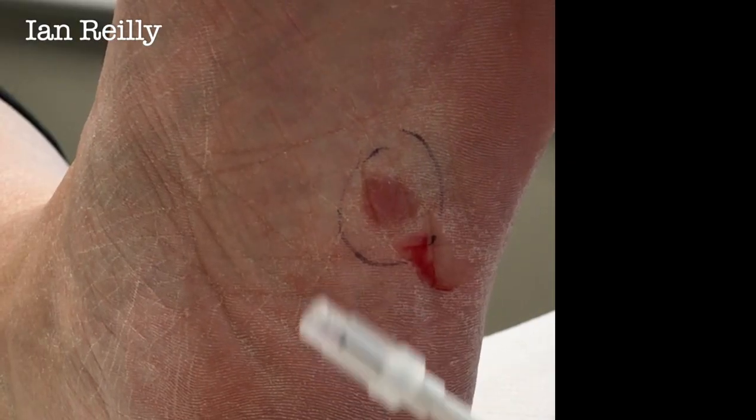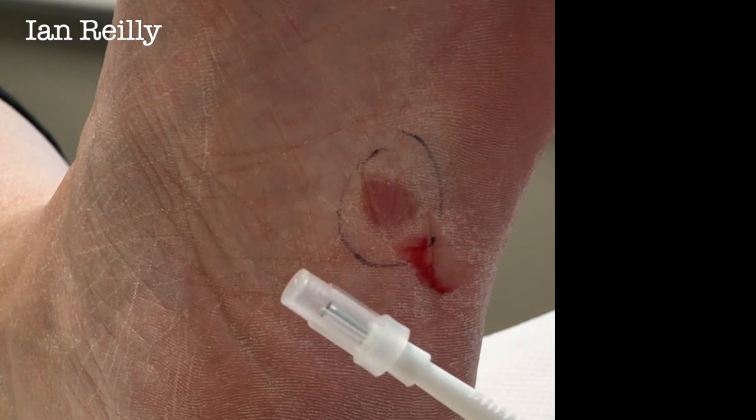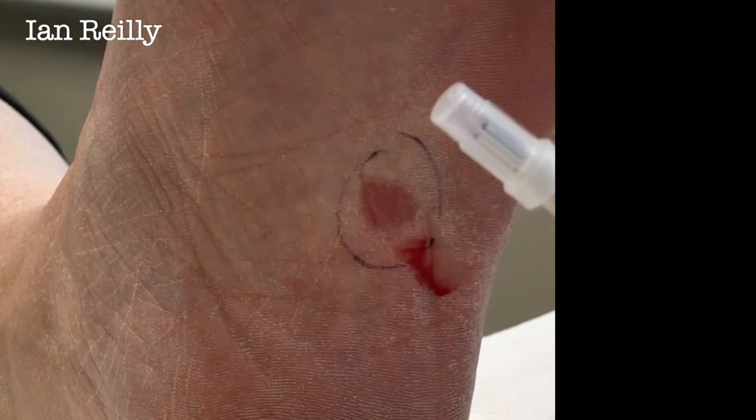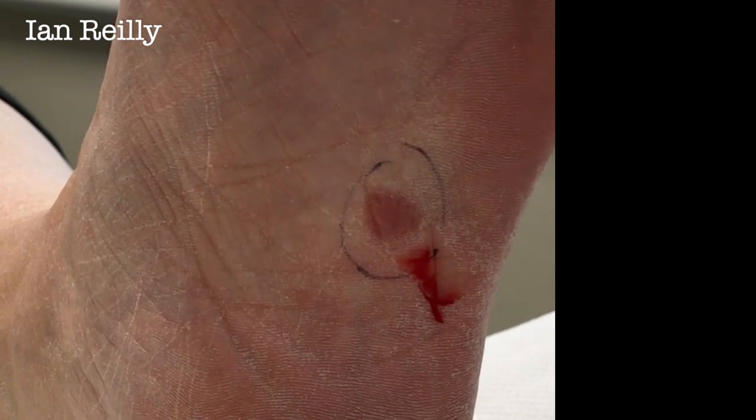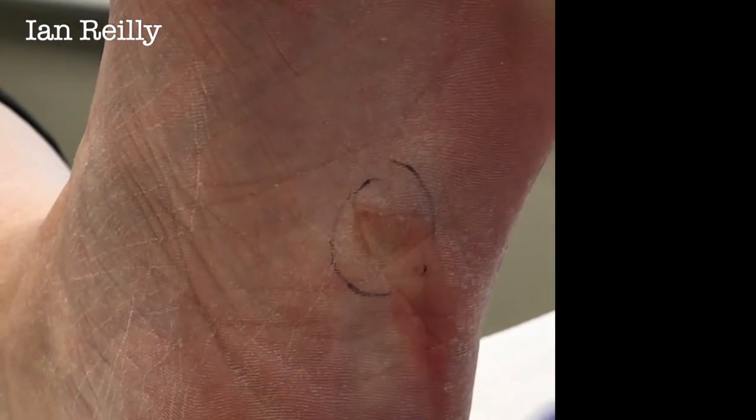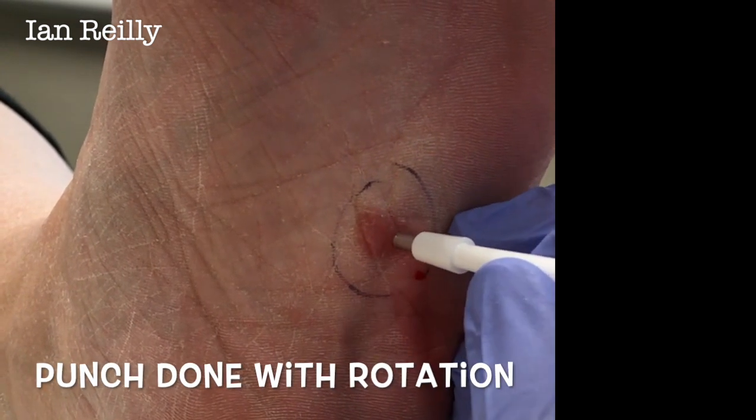Here's our punch biopsy. They come in two sizes. And you know what the two sizes are, Lisa? Small and large. Very close. Too big and too small. Very good. Very close. This is a 3mm punch. And we're just going to take a little sample.